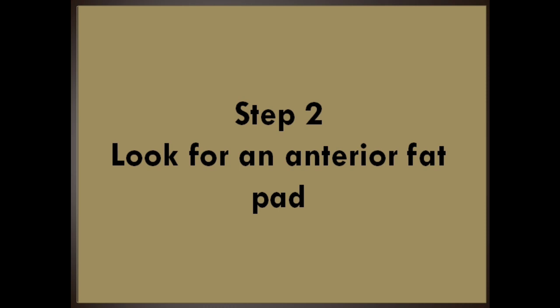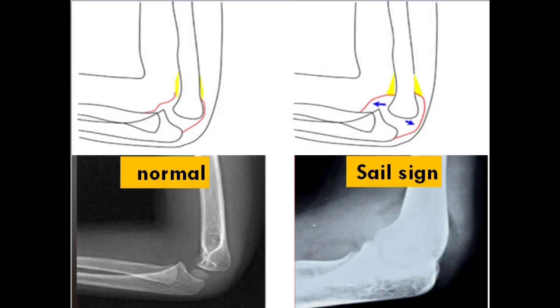Step two: look for an anterior fat pad. The fat pads on the lateral flexed view — it is important that the view is a true lateral. If not, abnormal fat pads can be missed. A small anterior fat pad is normal; it is a small radiolucent shadow adherent to the anterior aspect of the distal humerus. But a large one, the sail sign, suggests intra-articular injury.